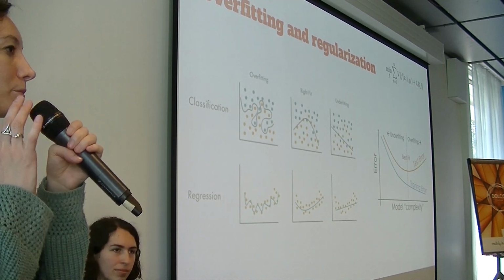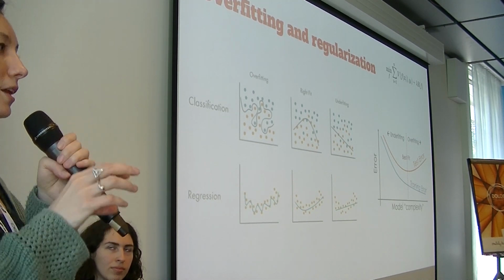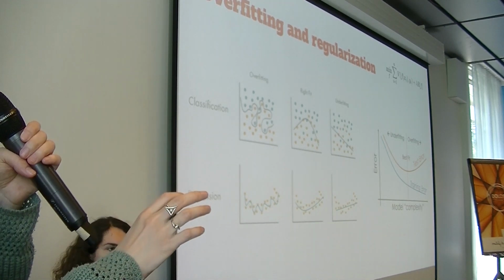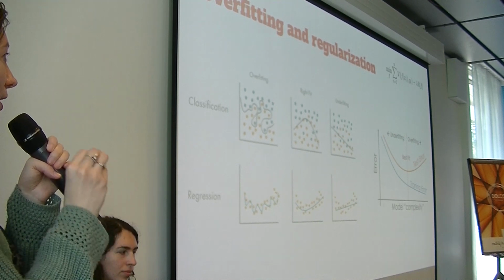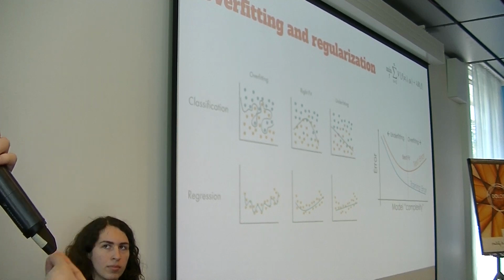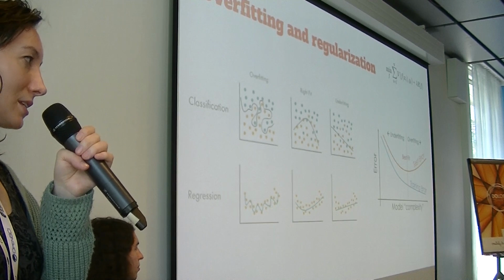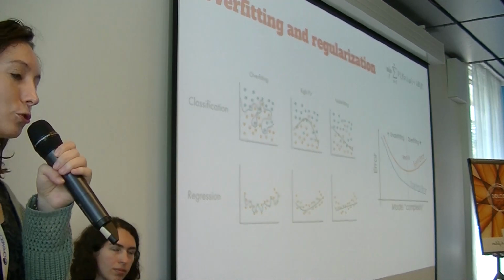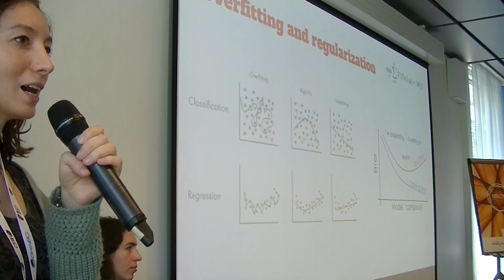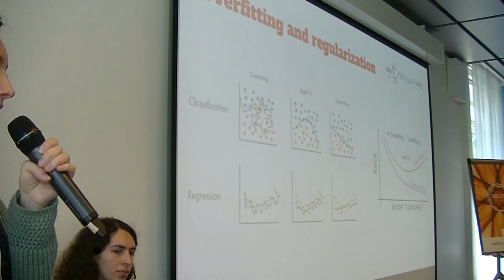Typically, you would divide all your data into 3 types of sets: train set, validation set, and test set. Then you use the train set to train your classifier. You can use a validation set to identify the best hyperparameters of your classifier, and in that case this would be the regularization parameter, so the one that controls this component. And then the separate test set you will use just to show what is the performance of your classifier on this completely untouched separate bit of data that was not used in designing of the classifier.